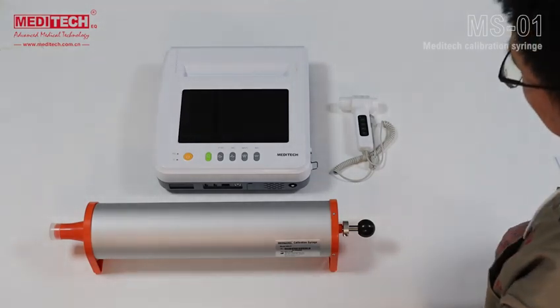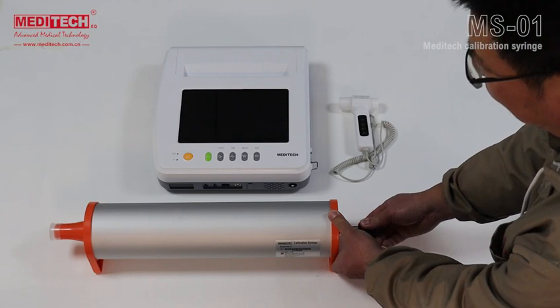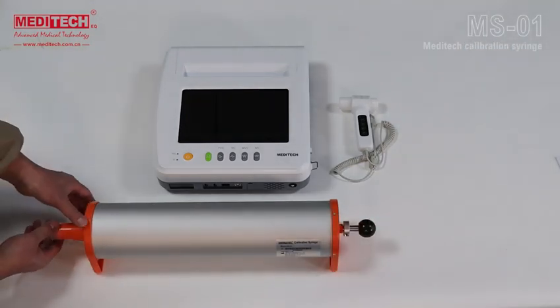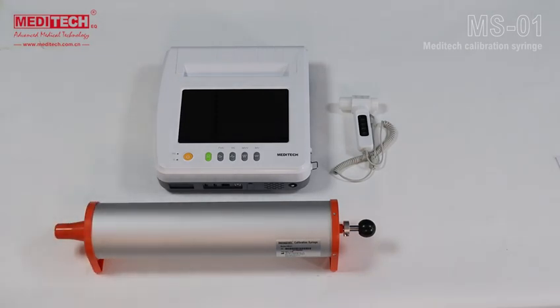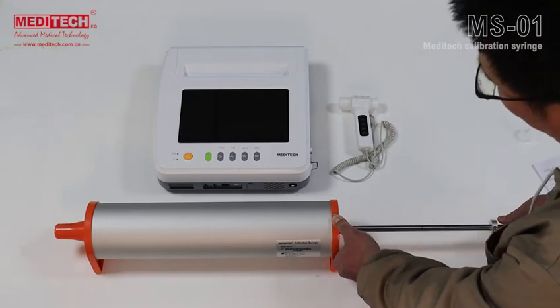The calibration process must be divided into two parts. The first part is the preparation for the calibration test. Remove the dust cover and make sure that the handle can be pushed and pulled smoothly and at a constant speed. Practice pushing and pulling in this way several times.